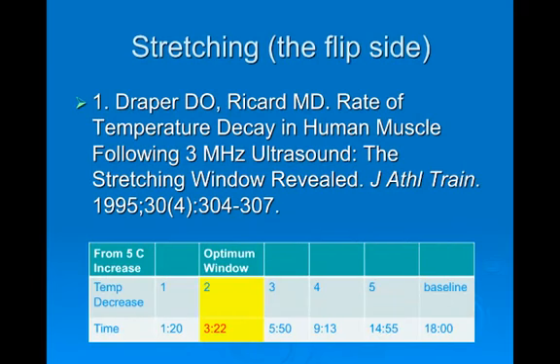But the flip side of this is how long does it take to cool off? Because that's what we're talking about here, is heating something up and doing some stretch to it. And so, doing some mobilization. So the thing that you need to keep in mind is you've got a narrow window. How quickly are things cooling down?